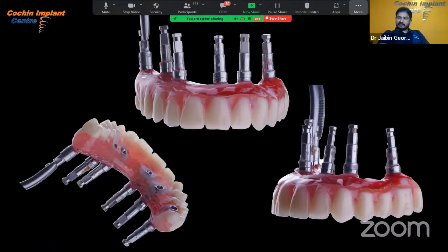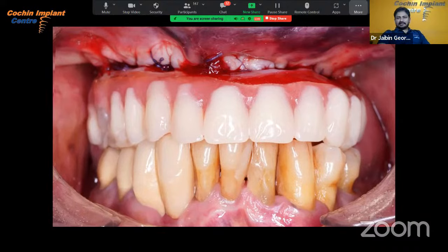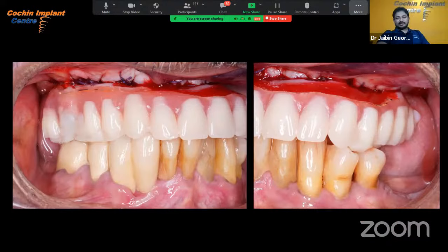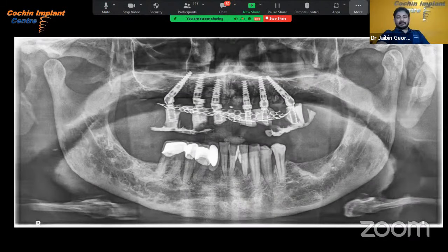This is the prosthesis which we made chair side, and it is delivered. It's not that beautiful, but the patient leaves the office with the prosthesis. Later we can change it. So you can see the right occlusal and left occlusal views. And this is the immediate post-op radiograph of the case.